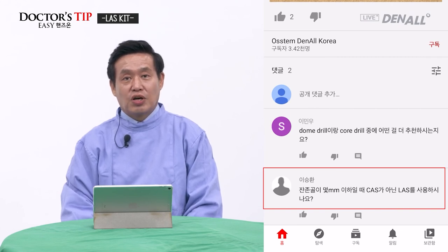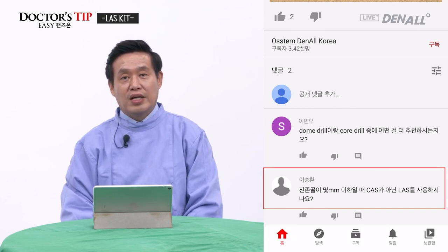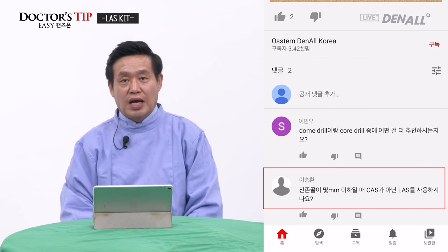But I think such a criterion has now become obsolete. Of course, the remaining bone height is important, but in a case where teeth number 7 and 5 exist and number 6 is a single missing tooth, even if the residual bone is less than 4mm, you still have teeth available right next to it, and if the sinus width is narrow, then I think it's possible with the crestal approach. Just in case, when you do a crestal approach, the most important thing is securing the primary stability.